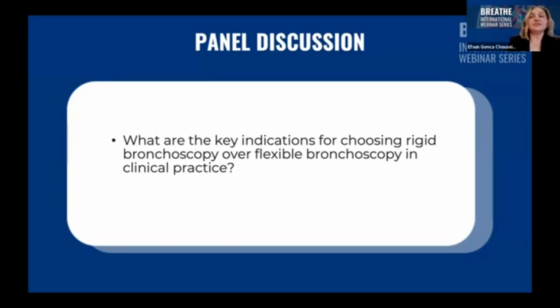This is a unique advantage, especially for hypoxic patients. You know, in ordinary surgical procedures requiring general anesthesia, patients with hypoxia or pneumonia are typically considered at high risk for postoperative pulmonary complications. In contrast, patients who gain the greatest benefit from rigid bronchoscopy are often those with critical central airway obstruction presenting with hypoxia or post-obstructive pneumonia.